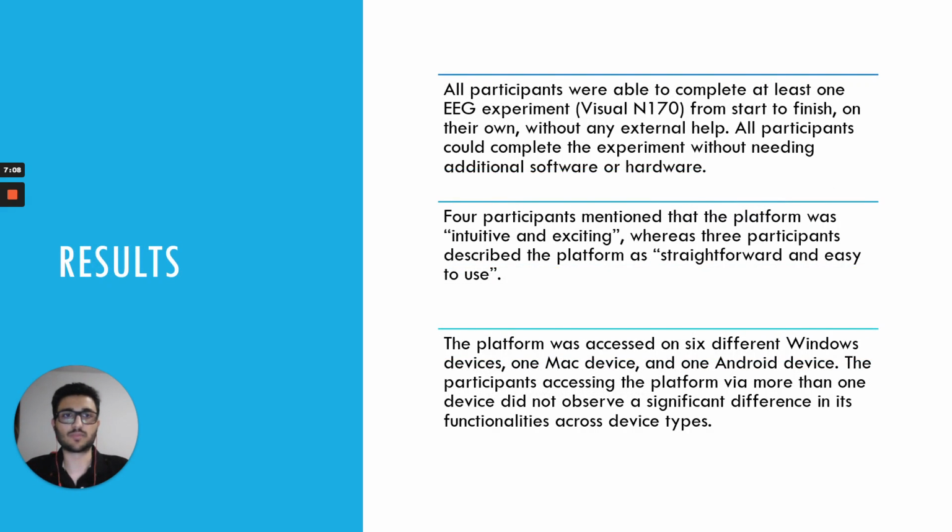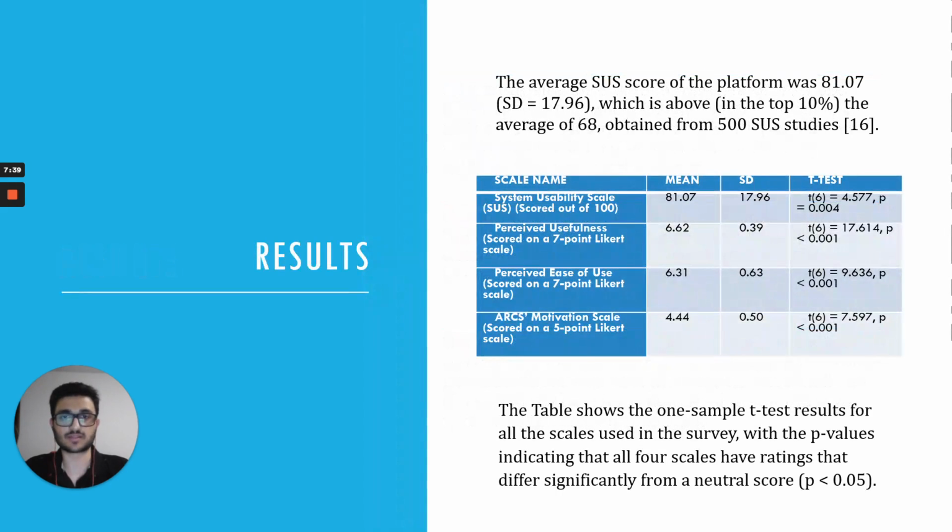All participants were able to complete at least one EEG experiment from start to finish on their own without any external help. All participants could complete the experiment without needing additional software or hardware. 4 participants mentioned that the platform was intuitive and exciting, whereas 3 participants described the platform as straightforward and easy to use. The platform was accessed on 6 different Windows devices, one Mac device, and one Android device. The participants accessing the platform via more than one device did not observe a significant difference in its functionalities across different types of devices.